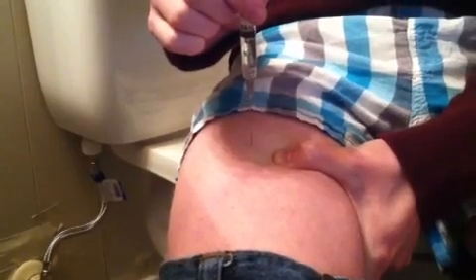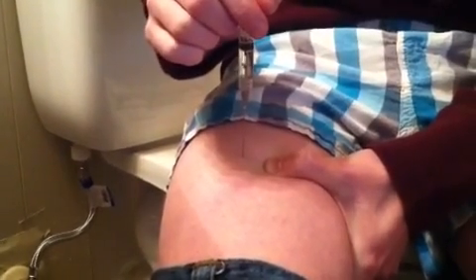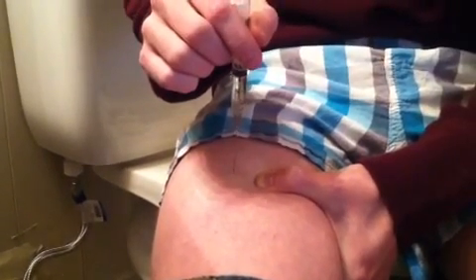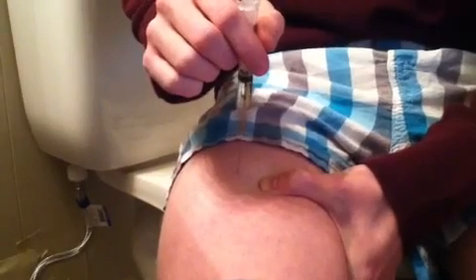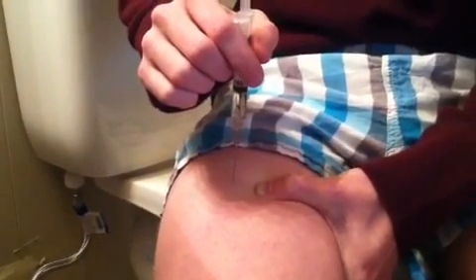Okay. Got it. And then you're going to tilt your needle over. I usually go a little bit slower because I want to make sure that it feels right. You can kind of feel if you're hitting a vein. I actually did that once. So you're going to push it in. I'm good. It doesn't feel weird. It kind of burns if you hit a vein and it doesn't feel comfortable. So you're going to kind of know.